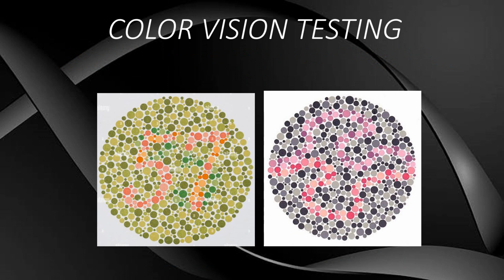Now we are going to read about color vision testing. The ability to differentiate colors has a dramatic effect on the activities of your daily living. For example, the inability to differentiate between red and green can compromise your traffic safety. Some careers, for example commercial artist, photographer, airline pilot, electrician, may be closed to people with significant color deficiencies. The photoreceptor cells responsible for color vision are the cones, and the greatest area of color sensitivity is in the macula, the area of densest cone concentration.